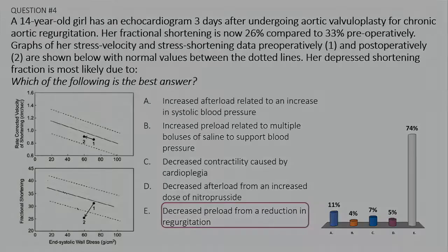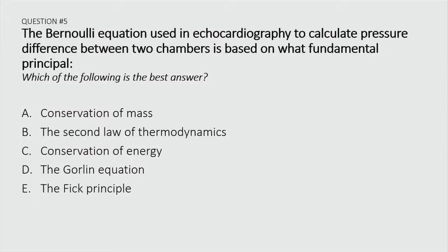Next question, please. The Bernoulli equation used in echocardiography to calculate pressure difference between two chambers is based on what fundamental principle? A, conservation of mass, B, the second law of thermodynamics, C, conservation of energy, D, the Gorlin equation, E, the Fick principle.